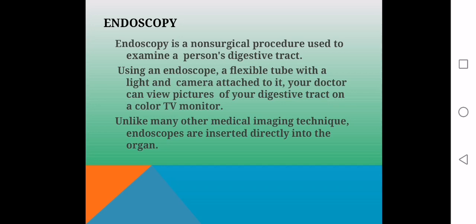Unlike many other medical imaging techniques, endoscopes are inserted directly into the organ, which basically means that a very tiny camera is introduced through your mouth to visualize the internal parts of your digestive tract.